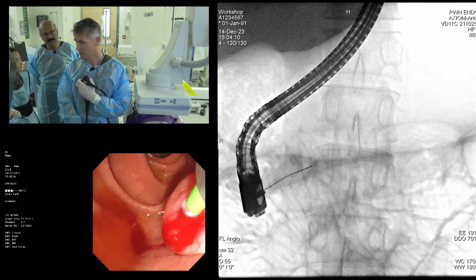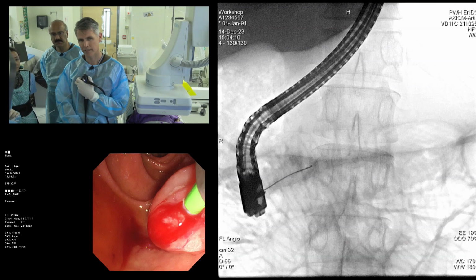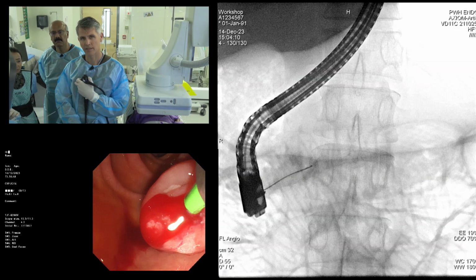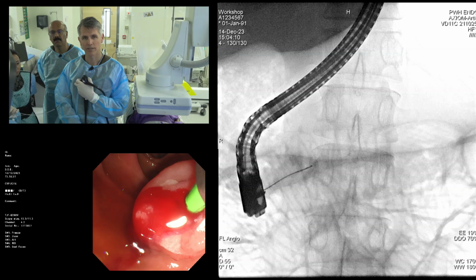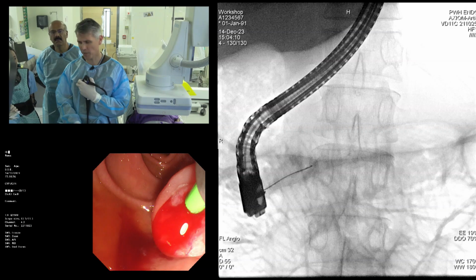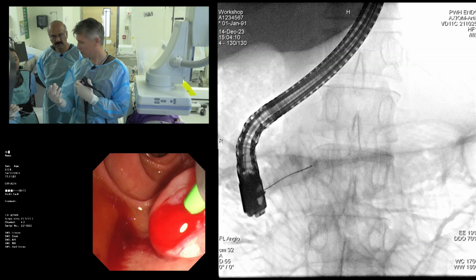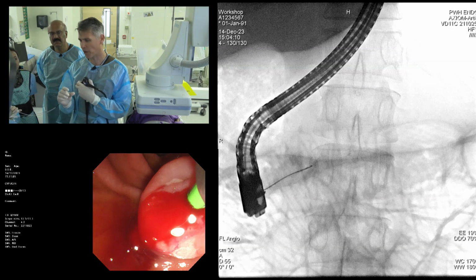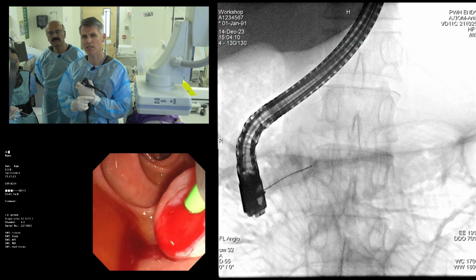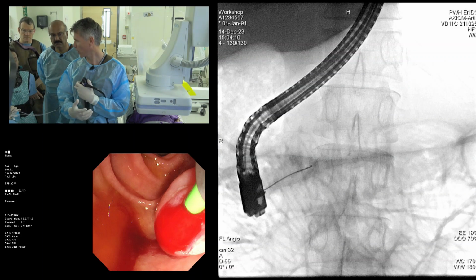I think surgery in a young patient like this, with a large impacted stone and dilated duct, is very easy for surgeons to tackle. Also it is very difficult for the ESWL to identify this relatively radiolucent stone. We can see it very clearly here. Maybe we can see it in front of the spine, but still it's difficult to target. But as you said, for the surgeons, if you have a dilated pancreatic duct, then it's easier to do the anastomosis. And here in this situation, the patient has a dilated bile duct as well. So this is a good reason to treat both ducts with one treatment.